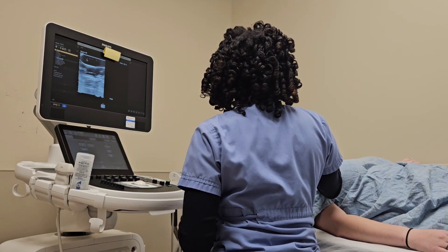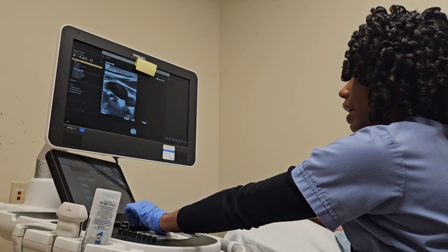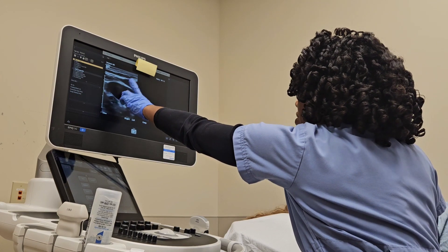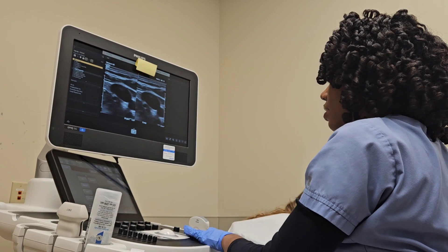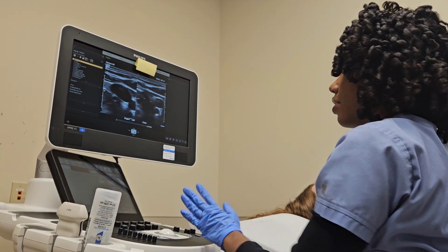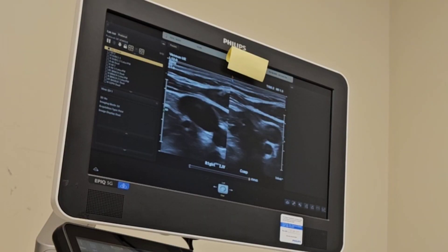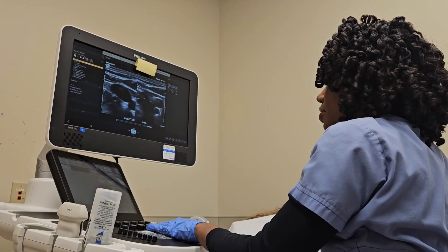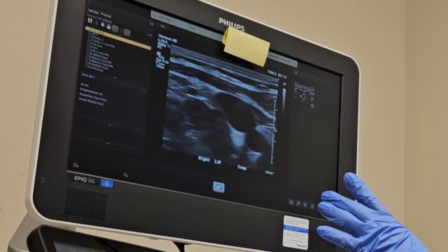Okay, warm gel. I'm going to start kind of near the base of the neck and turn my gain down some. The internal jugular vein is usually more anterior to the carotid artery — don't want to scan the carotid artery, just the jugular. So I'm going to compress. You're not going to choke the patient if you're using the right amount of pressure, but don't push too hard. I'm compressing until you can't see the vein too much anymore. There's my first image, starting on the right side. I've now taken the transverse image.